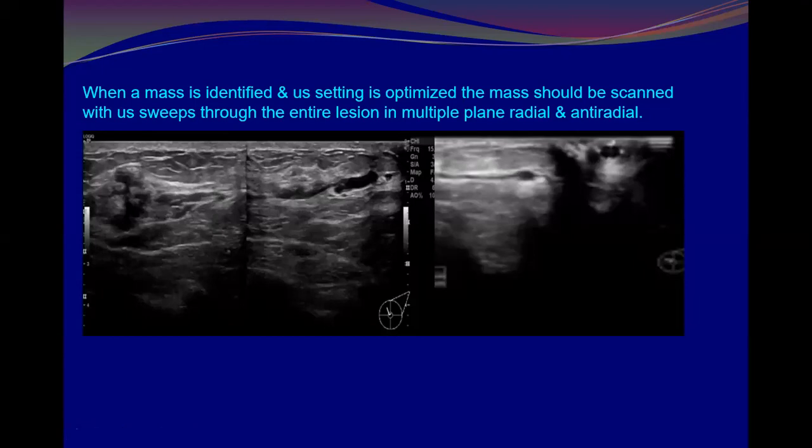What is the name of this image? I'm talking just about this part. Technique for this image. Can I measure the duct here?